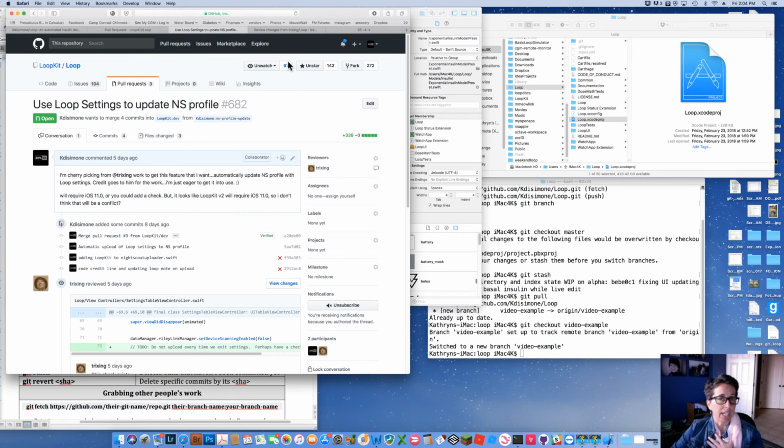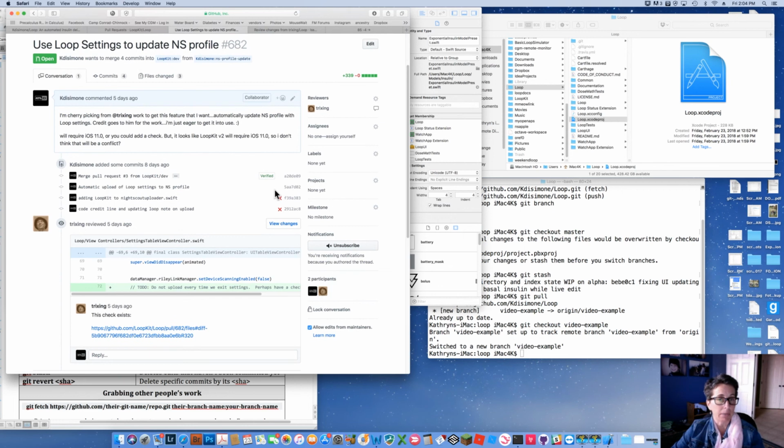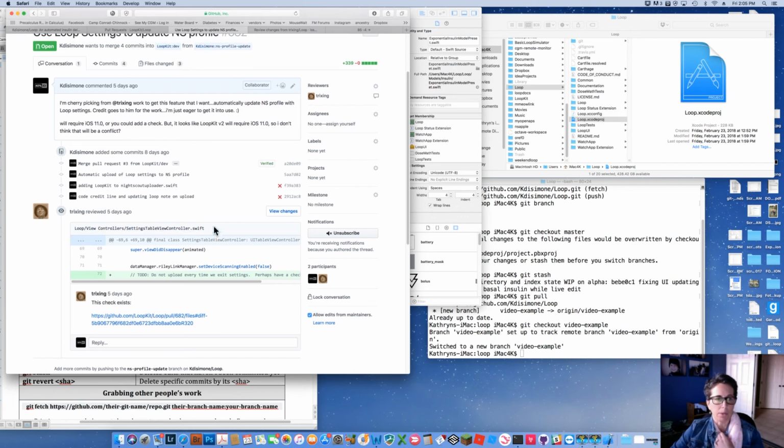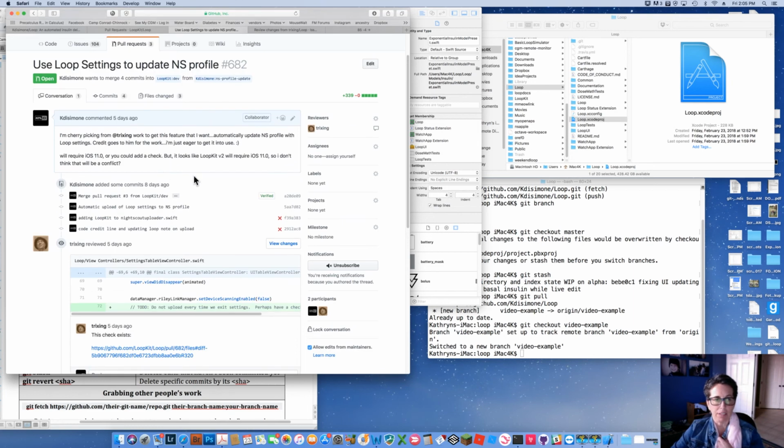Now, I didn't develop this code. Like I said, I found it on somebody else's repository, and they hadn't submitted it yet in that form. So I submitted it and tagged that person. I said, I'm borrowing from this person to get what I want. Well, that person wrote back and said, hey, by the way, part of that has been addressed over on SettingsTableViewController line 72. You could change that up. So that's good feedback. After I submitted the pull request, somebody said you should make some changes. So I can actually go and take this suggestion and make an update to my Nightscout profile update.